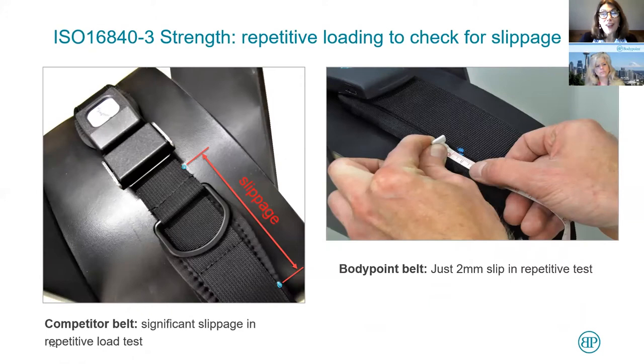As you see, there's a lot of force that is applied. After a thousand repetitions, if you look at the right, there was the original blue mark. After 1,000 repetitions, the BodyPoint belt slipped just two millimeters in the repetitive test. We have also tested some of our competitors' belts — we'll call this Brand X — and you can see that at the same test there's a considerable amount of slippage.